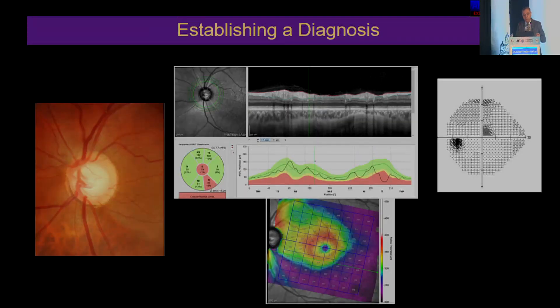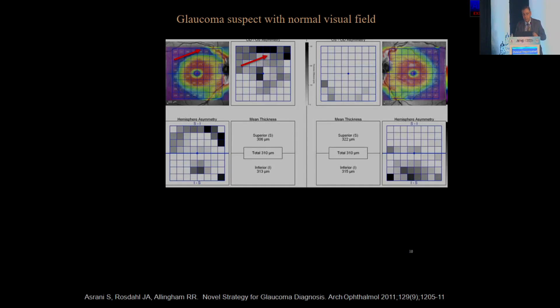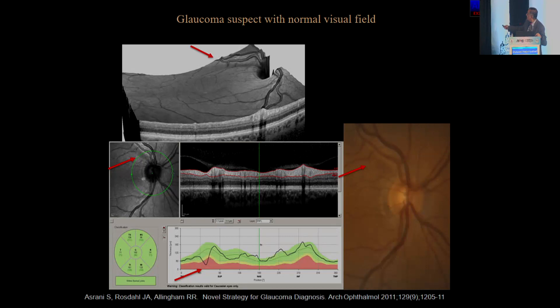Let's look at a complete example. You can see in this case there is a loss of nerve fiber layer, a loss of thickness, a loss of macular thickness, and a superior paracentral loss. There is also a normative database that allows you to see loss of nerve fiber layer and loss of ganglion cell compared to normal. Here is an example of asymmetry between the two eyes — an arc-like asymmetry in the right eye indicating very subtle thinning. On the 3D reconstruction, you can see the gutter of the nerve fiber layer defect, and you can see it on the color image.